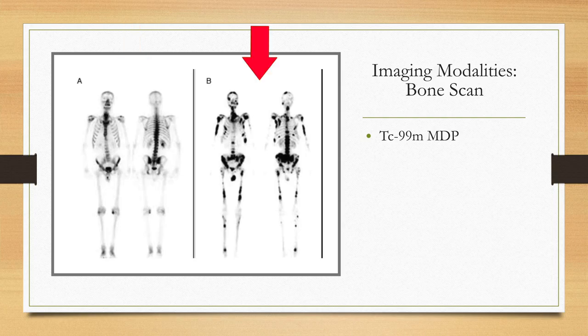If you have osteoarthritis and you get a bone scan, you're going to see uptake there because the bone's remodeling with the wear and tear. But generally, if it's symmetric like this, we're not worried that there's cancer in your knee. This is when we'd be more worried. So this is widely metastatic disease. We see abnormal areas of uptake throughout the skeleton.